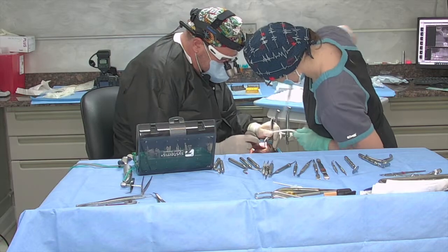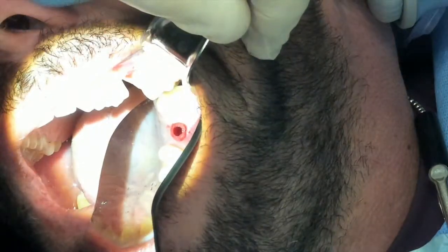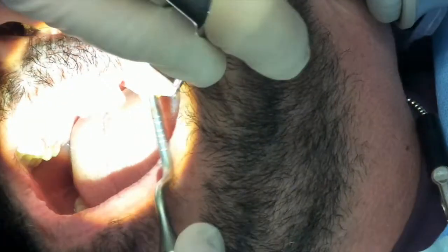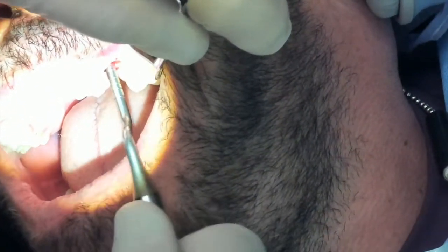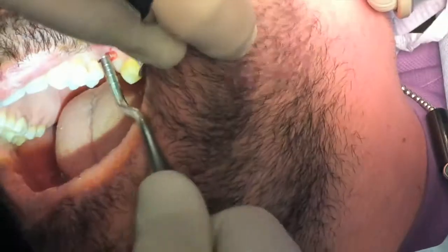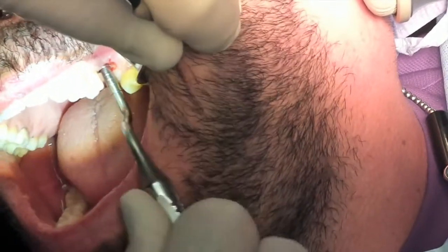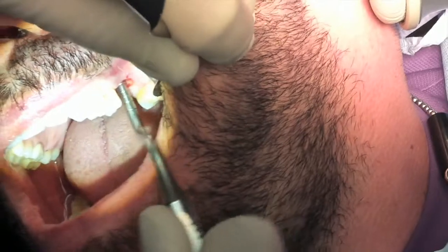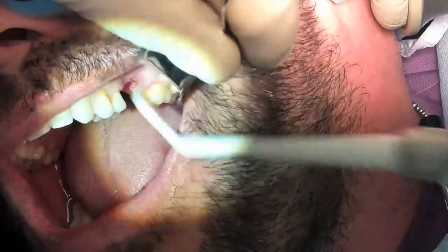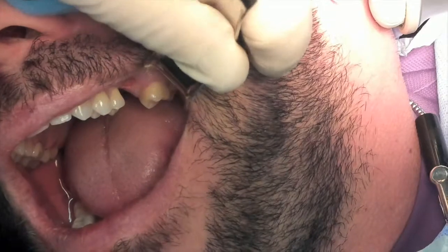Perfect. Okay, one more time. All right, site is there. Perfect. Now we're going to go back to the 3.8 osteotome. Pressure again. Now we're at 8. I'm making it a little wider. You see the floor of the sinus is still there? Perfect. Okay, back to this again.